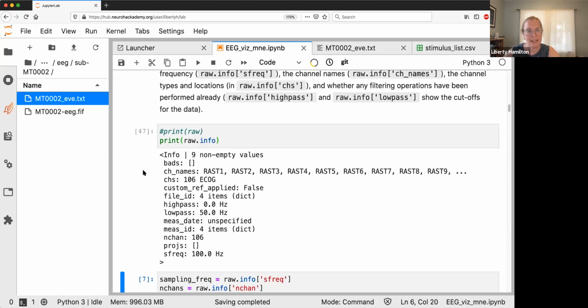And then people often do the electrode localization with a CT scan that's been registered to the MRI, or there are also MR compatible intracranial electrodes, so you could immediately get those localizations. For the EEG, I think you can do both.